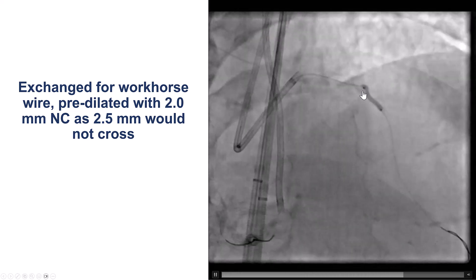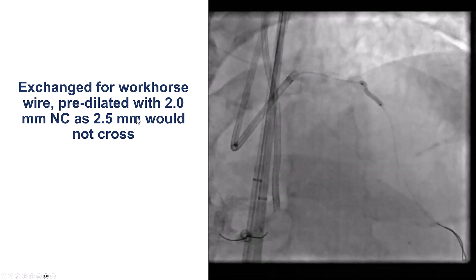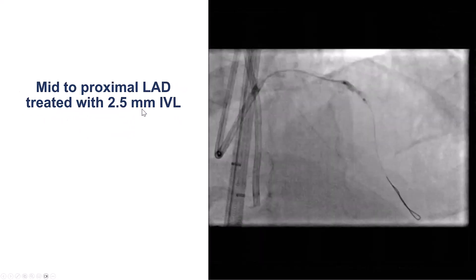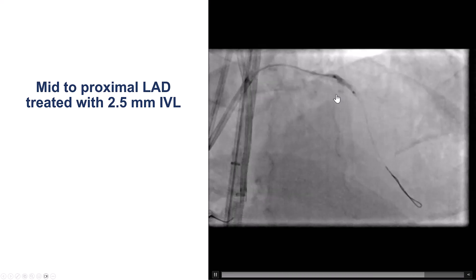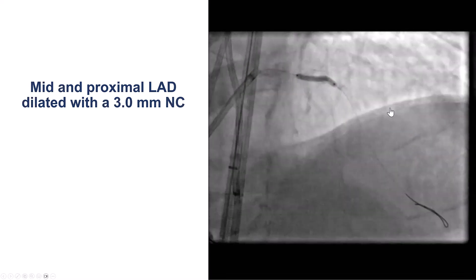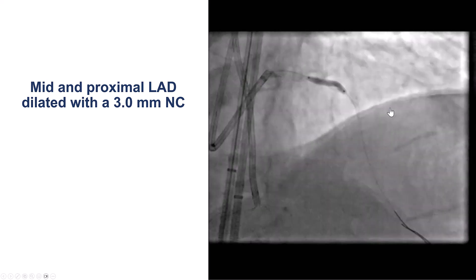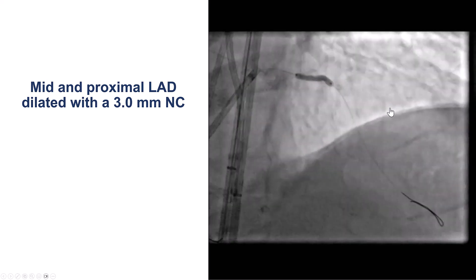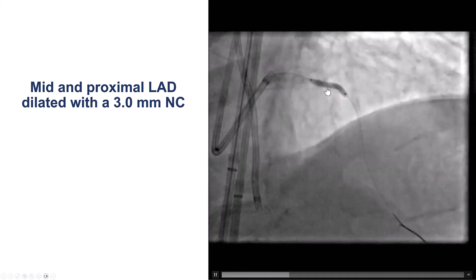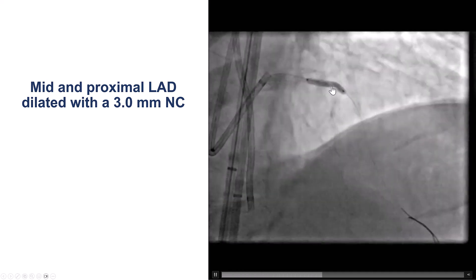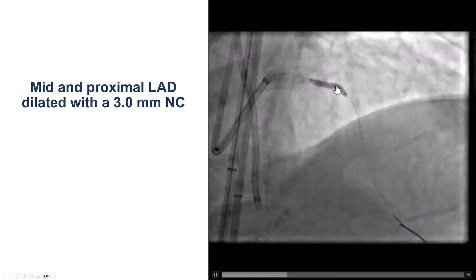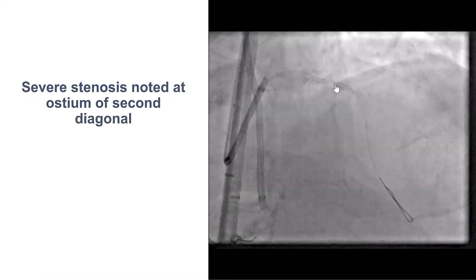We do see there is a waist on the predilatation balloon. We then used intravascular lithotripsy with the Aero, the newer intravascular lithotripsy catheter. We did 120 pulses, and then dilatation with a 3.0 mm NC balloon after doing IVUS, which seems to expand well. There is still a slight area of underexpansion right at the area of the bend, which is distal to the CTO and corresponds with the significant calcium.